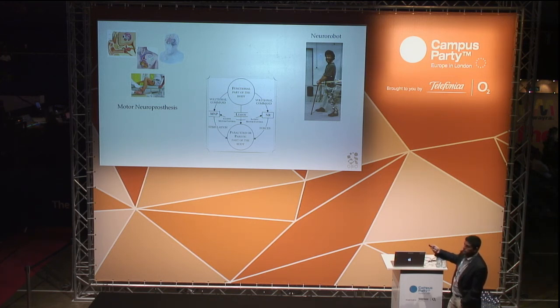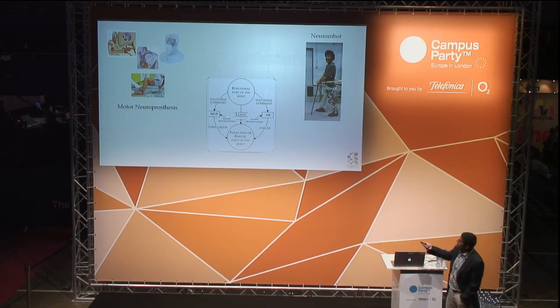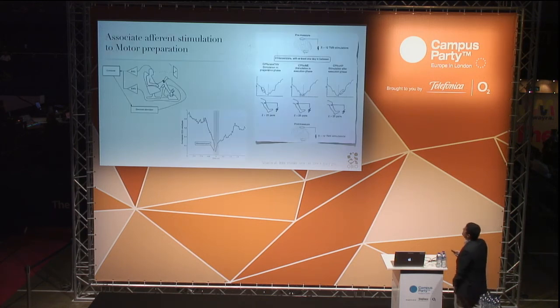to help restore function. So we get information on what is the intention of the user, the patient, and then we use either electrical stimulation, in this case here, or forces applied by the robotic exoskeletons, in this case here, to move the limbs to help the patient to restore function and ideally to rehabilitate function. Yeah, if this is not possible, then to substitute function.